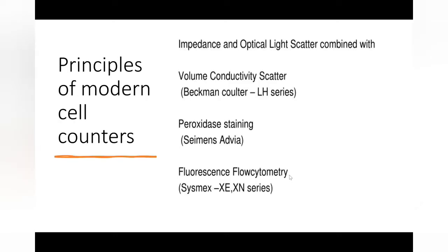As we all know, the modern cell counters are based on various principles. It can be either VCS, that is volume, conductivity and scatter principle, which is in Beckman Coulter's, or peroxidase staining in Siemens, and fluorescence flow cytometry in Sysmex.